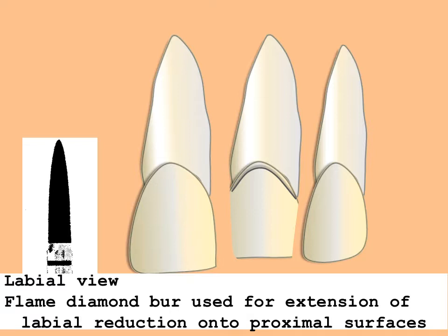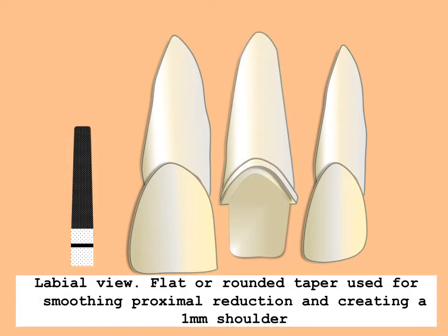One should become confident using a dentoform model and practicing this preparation prior to attempting it on a patient — measure twice and cut once. Using a labial approach, the flame-shaped burr is used to access the proximal. When sufficient space has been created, the 6847 taper is held parallel to the long axis of the tooth and used to form the shoulder and create the necessary taper. It is crucial to avoid over-tapering the preparation. Better results will be obtained using a gentle sweeping motion with light pressure and copious water spray. Worn or damaged diamond burrs should not be used. All sharp line angles should be rounded.